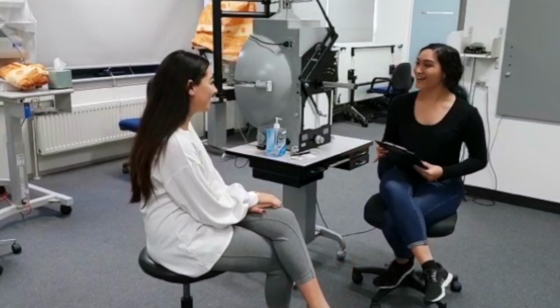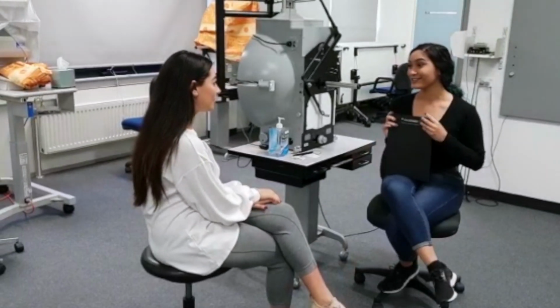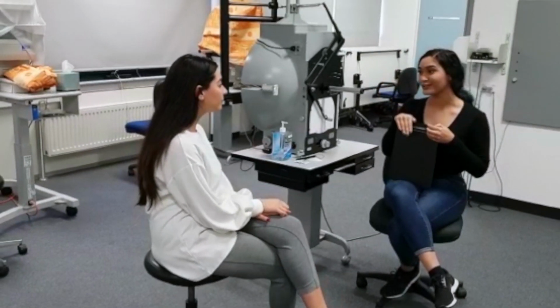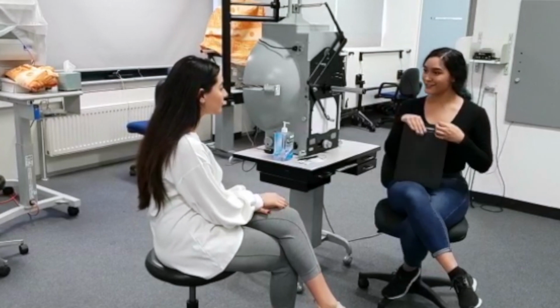That's okay. So, today we're just going to be doing a visual field test. So, it's pretty much what you can see to the left and to the right and top and bottom while you're looking straight ahead. So that's just what we're doing today.